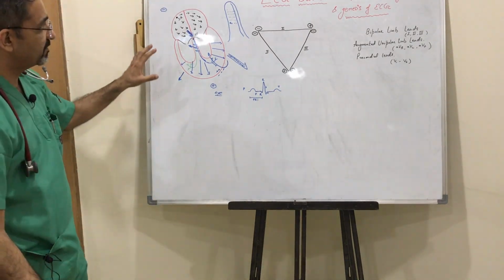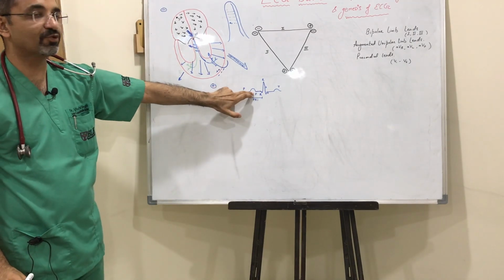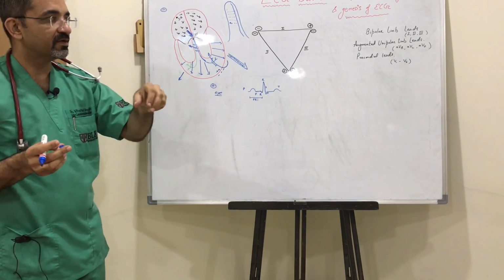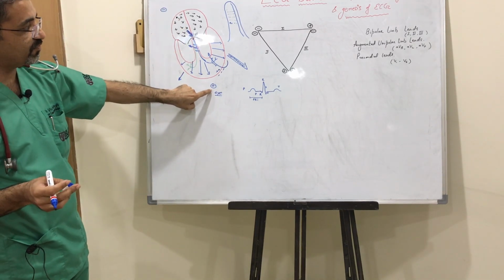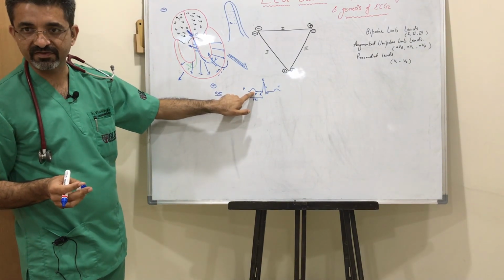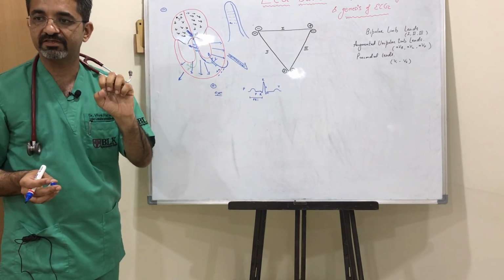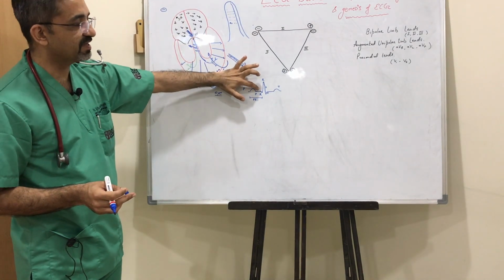Okay, so I'll summarize this again. PQRST. P wave means atrial depolarization. You have small vectors which are distributed widely over the atria, but when you add them mathematically, the resultant vector is down towards the AV node, which is picked by this eye of lead 2 and is given a positive deflection known as P wave. Then you have a PR segment. PR segment is nothing but that the charge has depolarized the AV node, but the AV node is holding the charge. It is not letting the charge go down the bundle branches. So it is giving rise to an isoelectric PR segment.